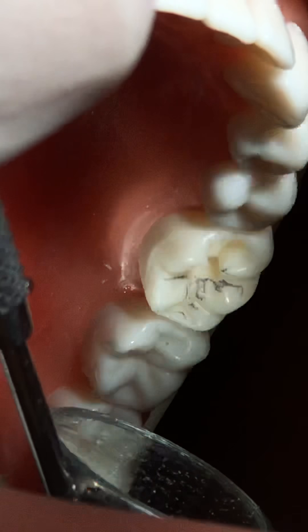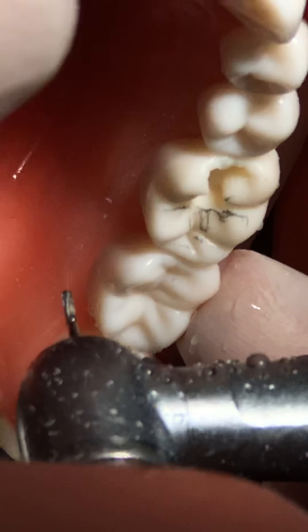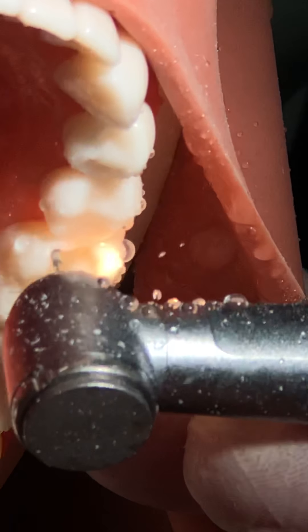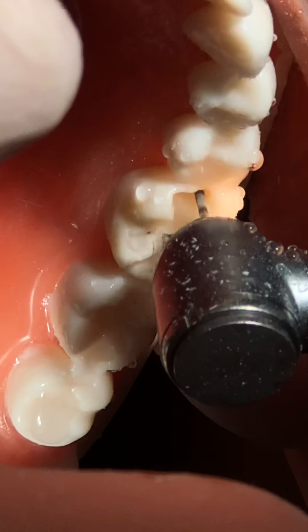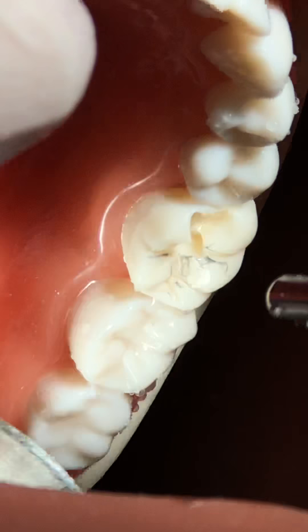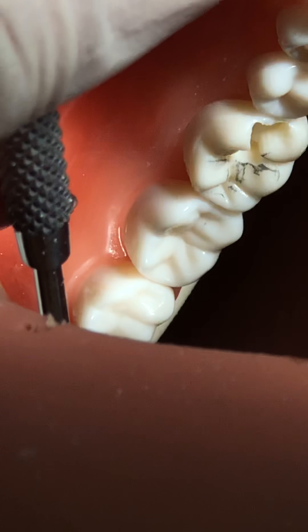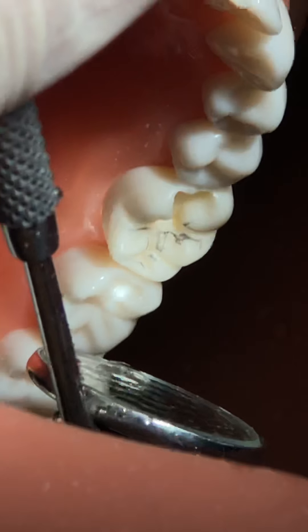Now we extend to the proximal. The important thing to remember is that the depth will remain the same until you remove the margin ridge. When you remove about 1 to 1.5 millimeters, stop, take your time and check again. If there is something wrong, now is the point to correct it. You can see I've extended it further and the margin ridge has become thinned out, but it is still thick enough that you cannot remove it with an explorer.